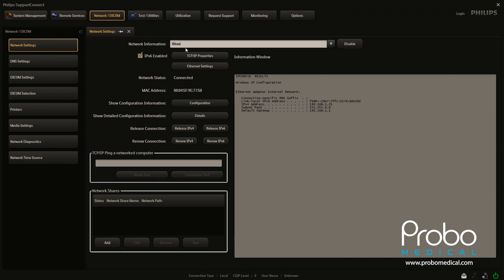And there's two types of connection to your network. There's wired and wireless. This particular machine is set up right now on a wired network. So if you wanted wireless, you would click this pull down and there would be a wireless option.